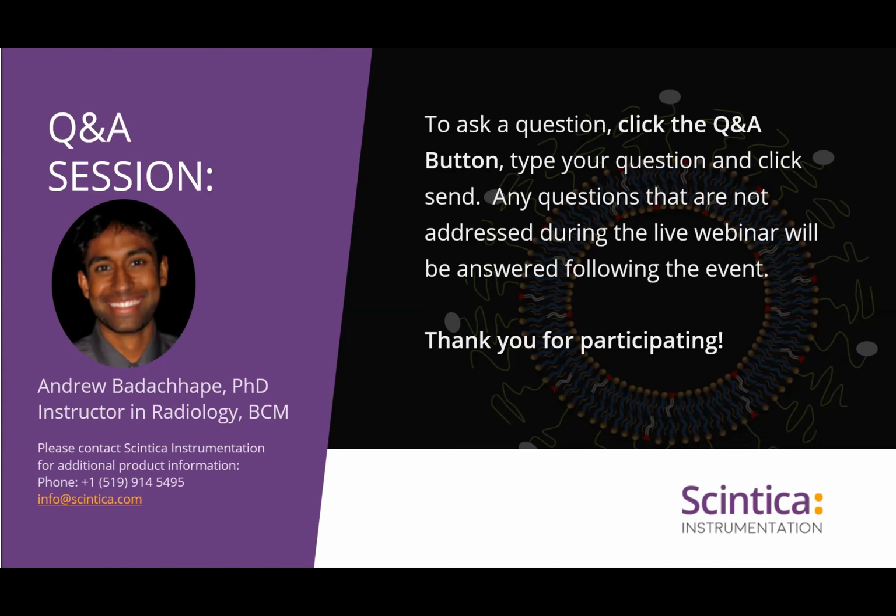What is the potential for being able to diagnose and understand what could be happening and being able to catch something very critical versus the cost of inflammation or other side effects from gadolinium? So when thinking about the translational impact for a contrast agent, we always have to be careful about that trade-off. And I believe that for the agents that I've talked about today, the benefit still outweighs the cost for potential issues with gadolinium, as long as the side effects and precautions are laid out front.